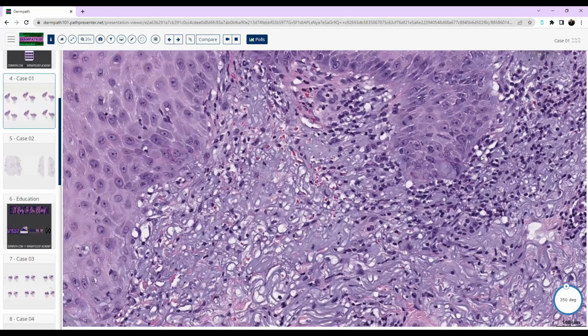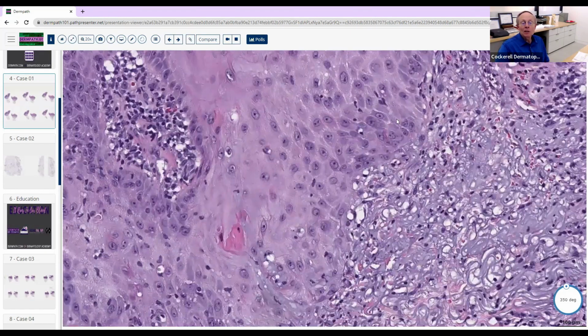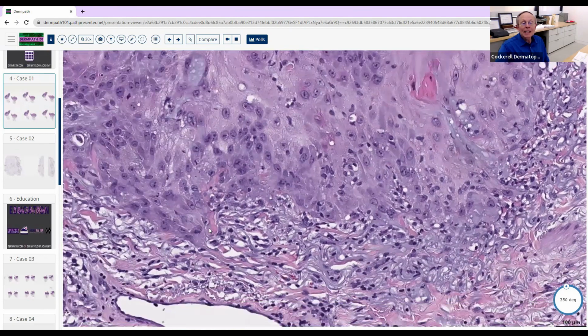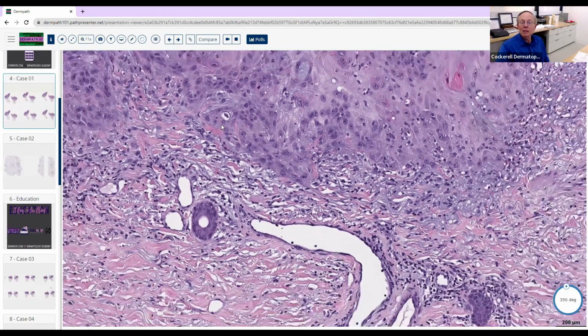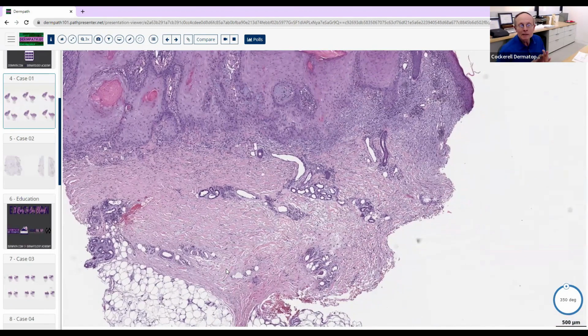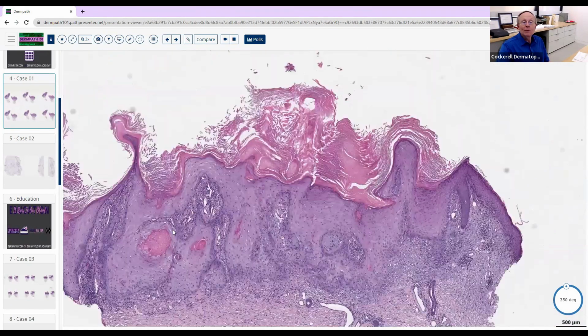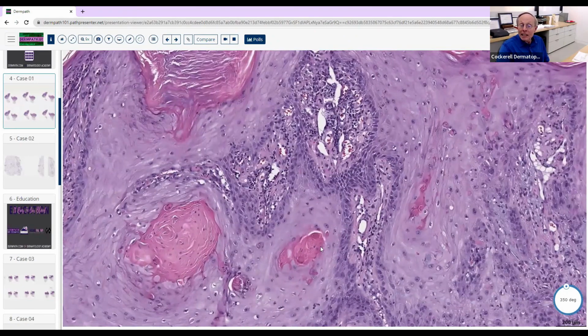Not exactly sure in particular. See these holes right here? Yeah. It's vacuolar alteration at the dermal junction. So it's an interface dermatitis. And if you look in another couple of areas here, we might even see some thickening of the basement membrane zone, like right here. Oh, yeah. Okay. So this is relatively subtle. Most of the time when we see this process, you usually see a superficial and deep, denser infiltrate. But we do have these areas here, which represent follicular plugging.